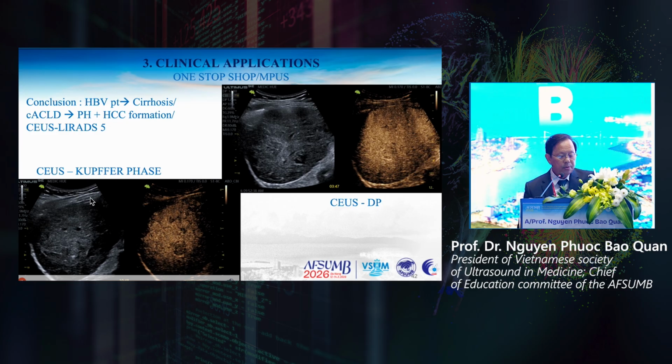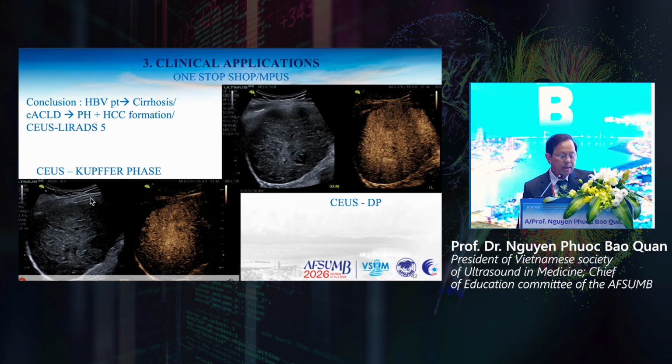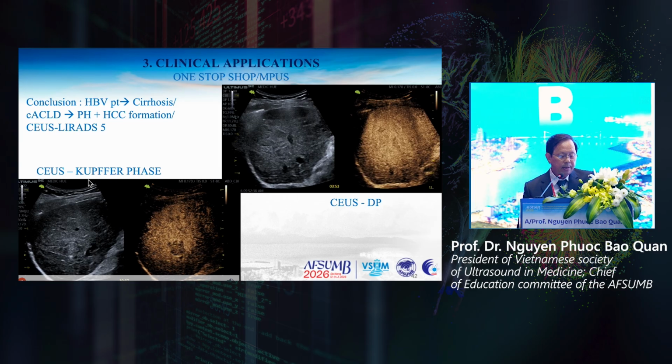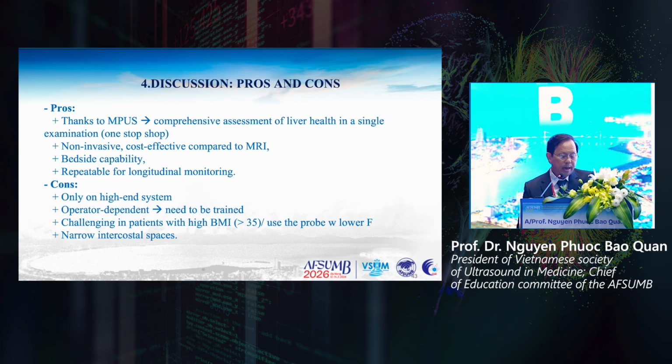Now I would like to move to the discussion. With multiparametric ultrasound, we have many advantages. Thanks to multiparametric ultrasound, we can assess the liver in a single examination. We can call it one-stop shopping.